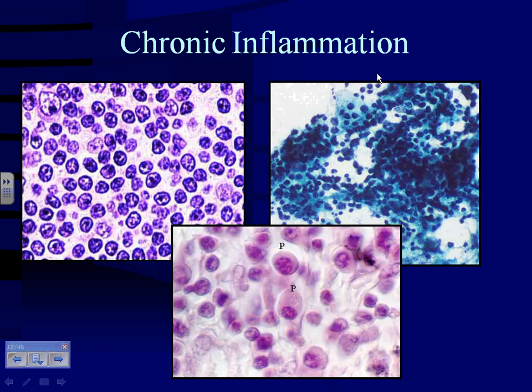But if you make out, there are some squamous cells here in the background, but the lymphocytes here tend to be single cells that are small with high NC ratio and dark chromatin. Here they are on Diff-Quik. You're not used to seeing Diff-Quik yet, but that's what they look like on Diff-Quik. And again, it's a discohesive population of small monotonous cells with very scanty cytoplasm.